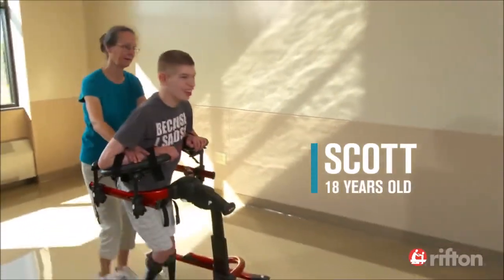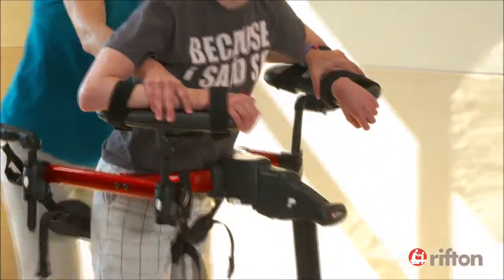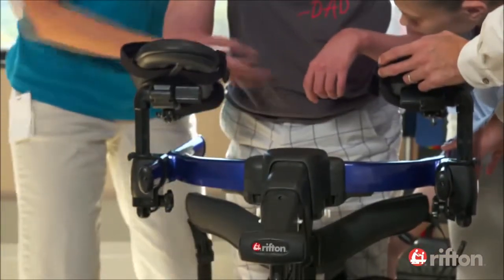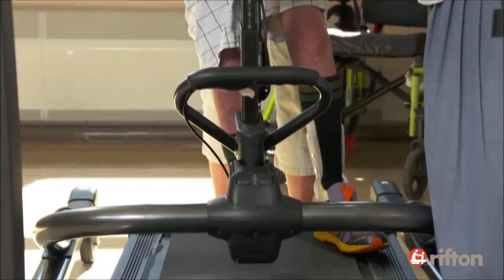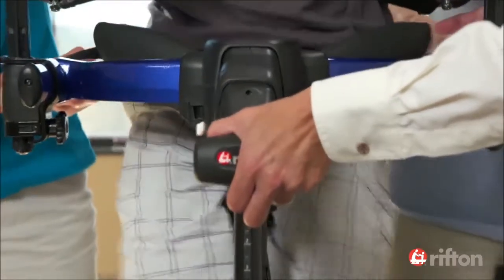Here we meet Scott, an 18-year-old with mild cerebral palsy and autism. Given his compromised strength and low tone, the treadmill will provide an opportunity to gain strength, endurance, and walking stamina. Here we see the dynamic upper frame placed on the treadmill's stability base. The built-in height adjustment of the base allows it to clear the treadmill while Scott steps up onto the belt.